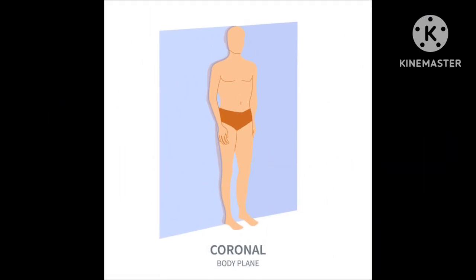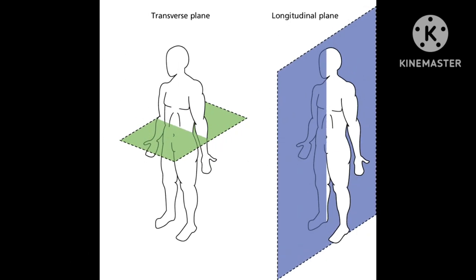This slide showing coronal plane which divides the organ or divides the fetus into anterior half or posterior half. In other words, it divides the fetus into in front or back part. Transverse plane or axial plane divides the fetus into superior part and inferior part. That is, it cut from right to left. Sagittal plane divides the fetus into right half and left half.